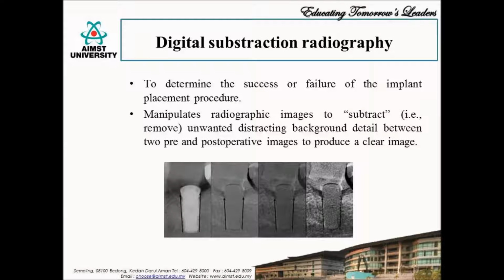Now I shall discuss digital subtraction radiography and how it is beneficial to implant dentistry. Once the implant procedure is done in a patient after the complete diagnostic evaluation, the clinician is faced with a new diagnostic concern: to determine the success or failure of the implant placement procedure. Detecting initial saucerization or formation of an angular bone defect around the implant is very difficult on these radiographs. In addition, because of the sharp contrast between the bone and the implant surface, the spread of bone loss along the threads of the root form implant is often more difficult to visualize.